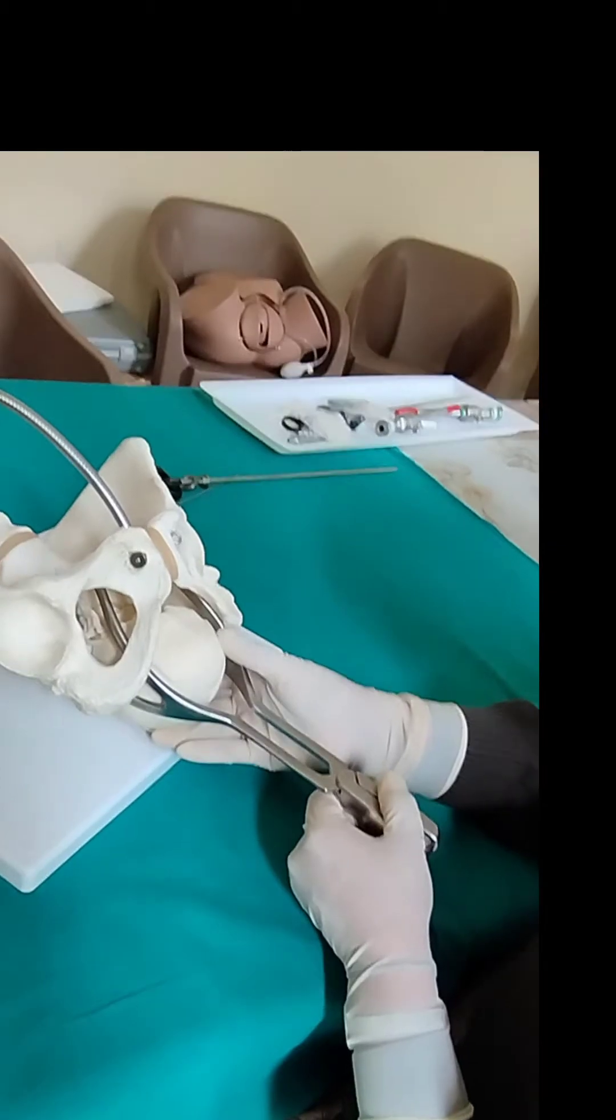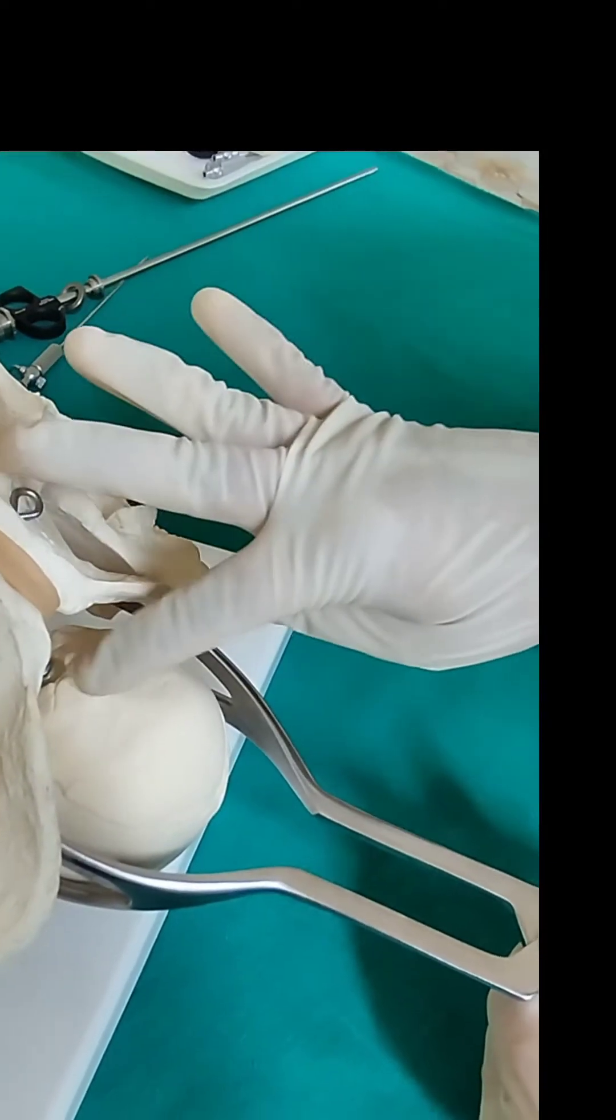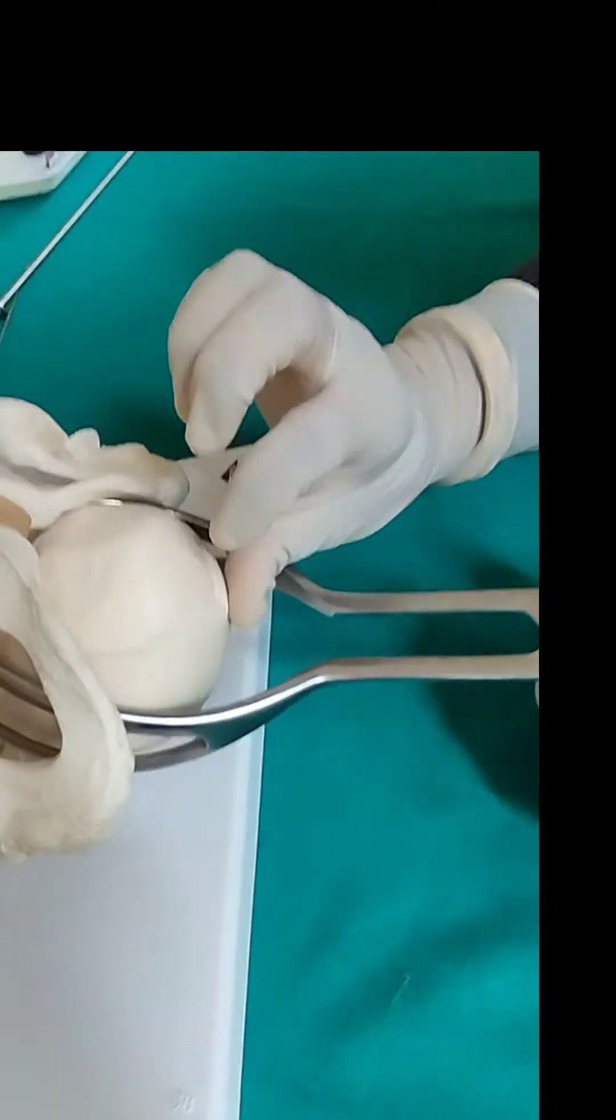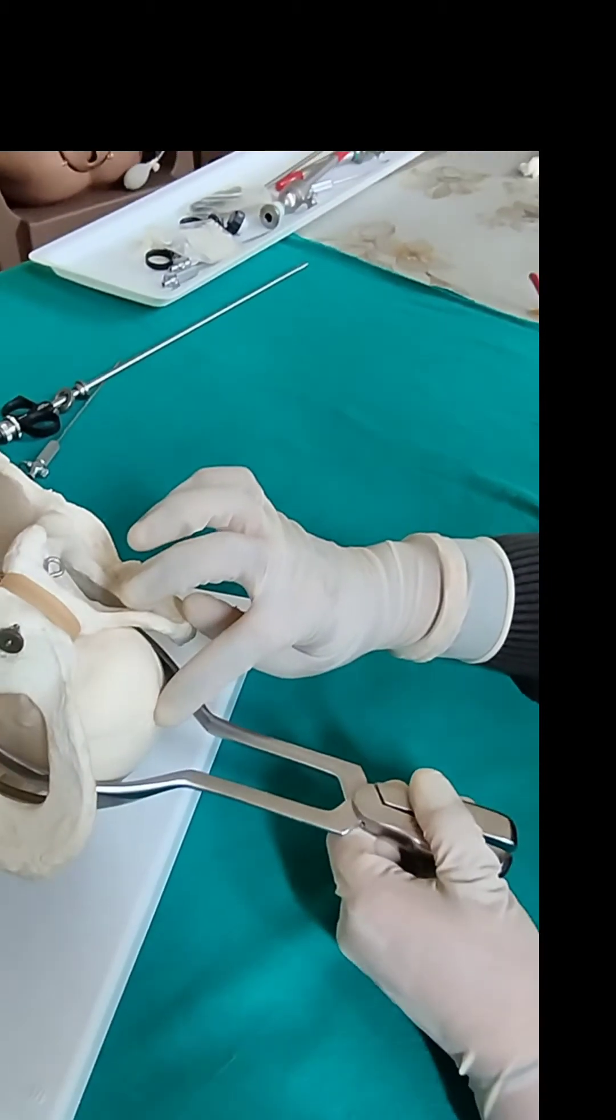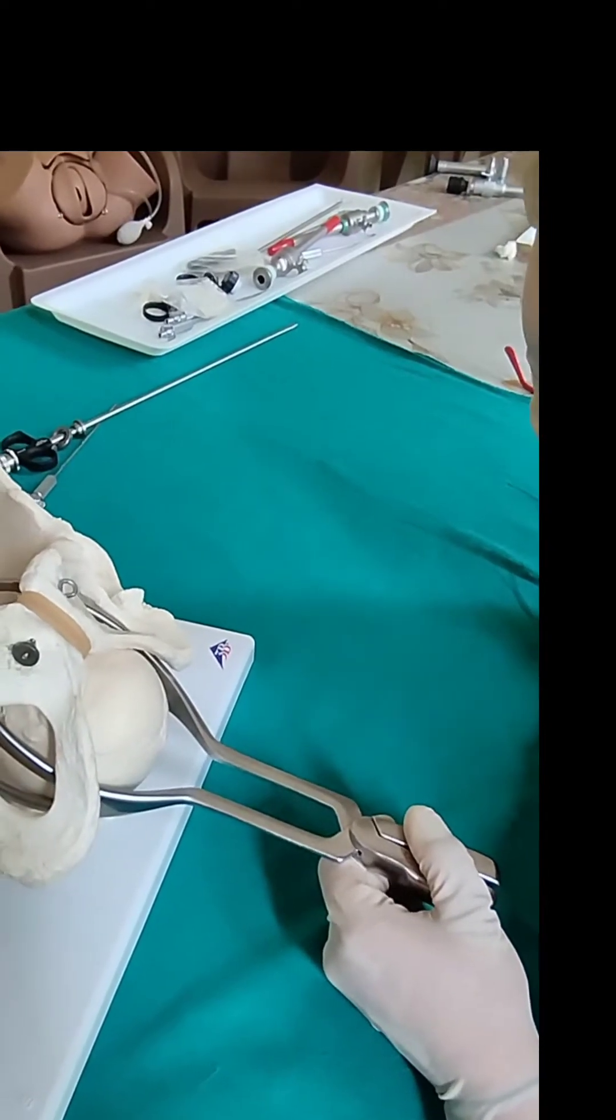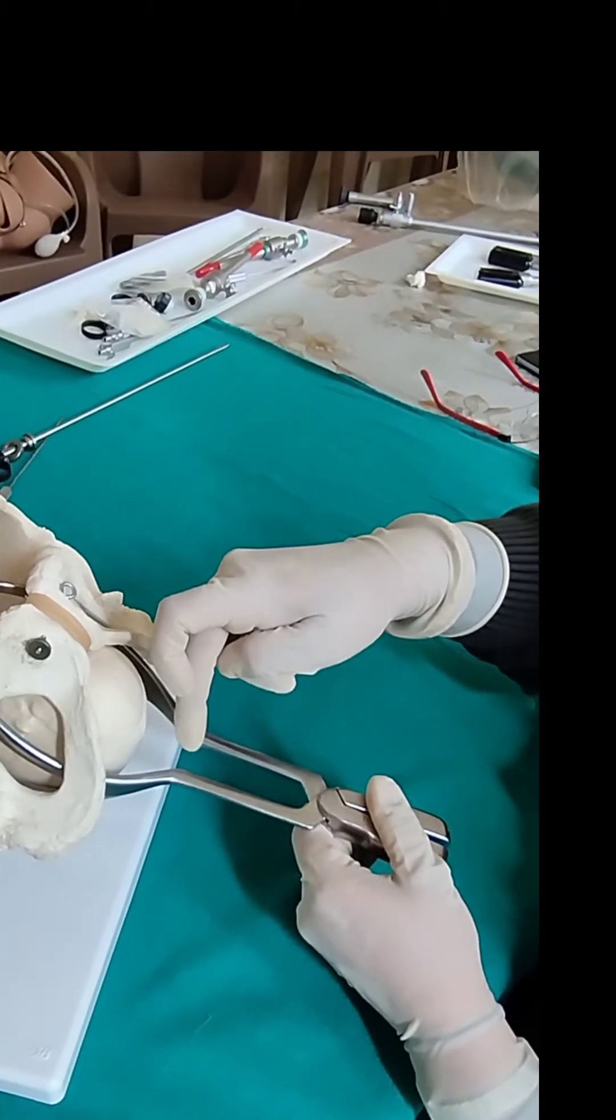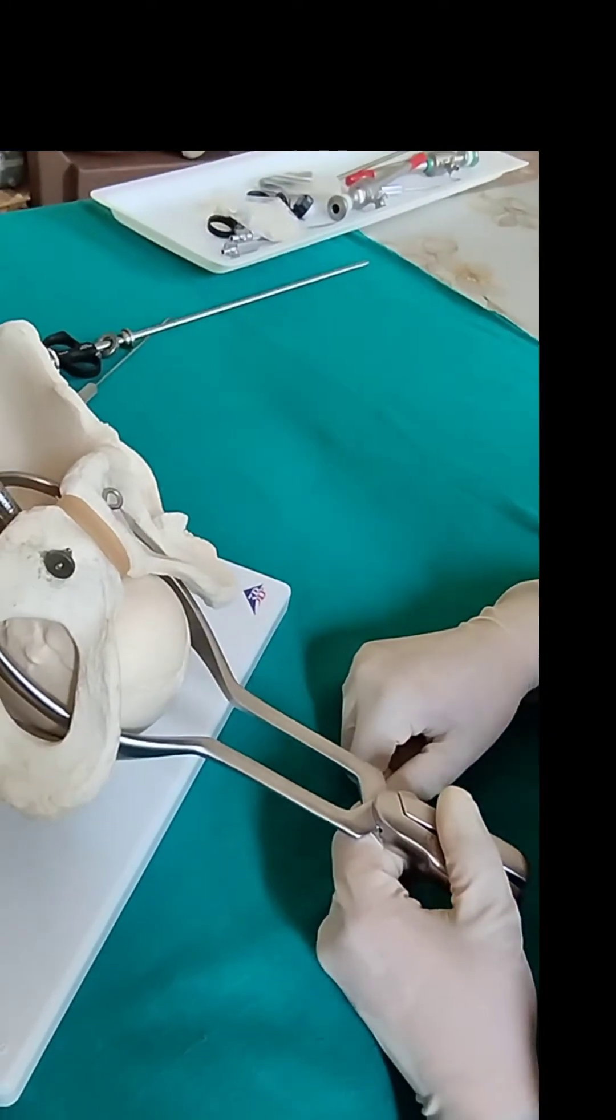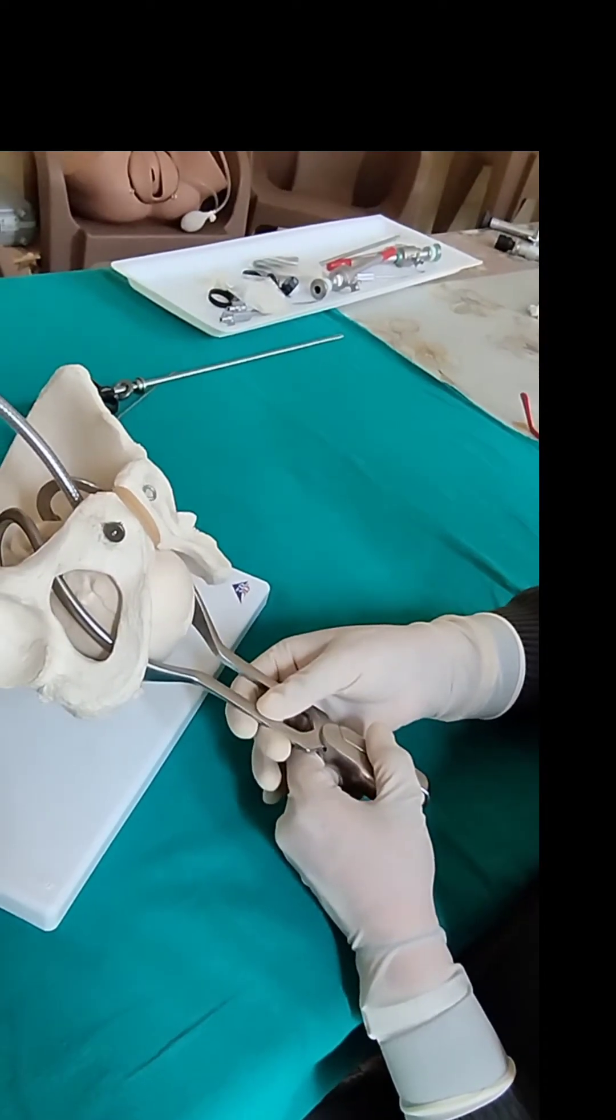After application, you have to ensure that the sagittal suture is in midline, the two blades are equidistant from the sagittal suture. The posterior fontanelle is about 1 cm above the shanks. The distance of the fetal skull from the shanks, this space should not be allowing more than 1 finger breadth. If the blades are locked easily, then the application is alright.